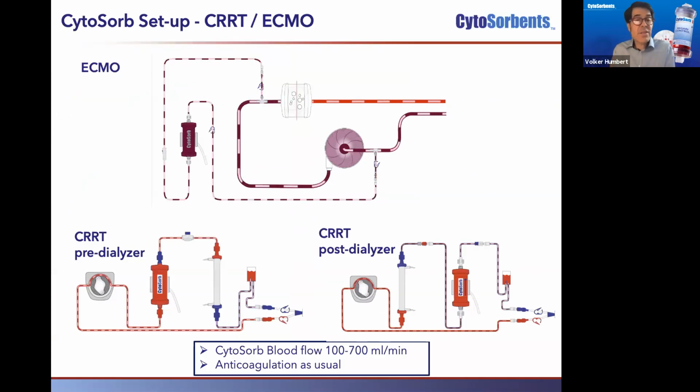Technically, you have other systems you can use Cytosorb with, so not the CPB, but the ECMO, the CRRT, and even, which is not shown here, a standalone hemoperfusion mode is possible. The same in regard to blood flow and anticoagulation applies.